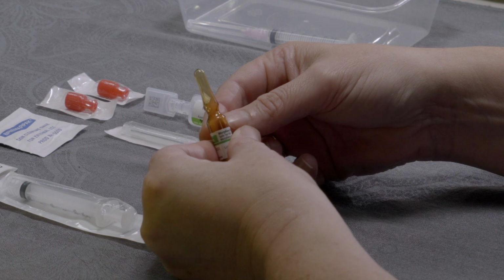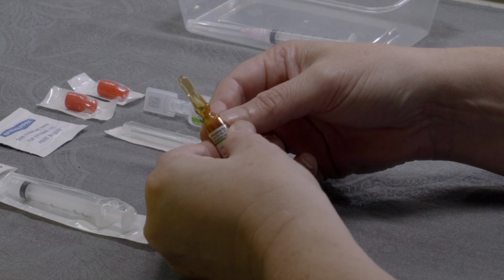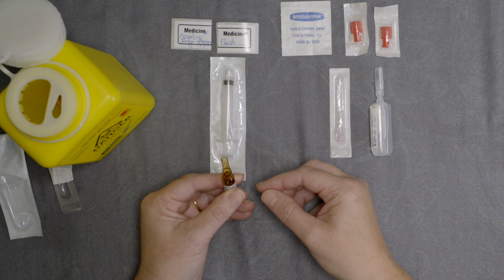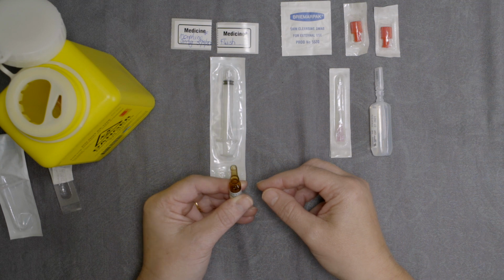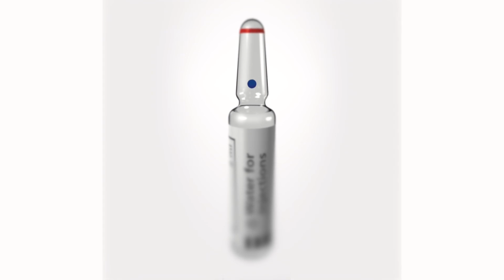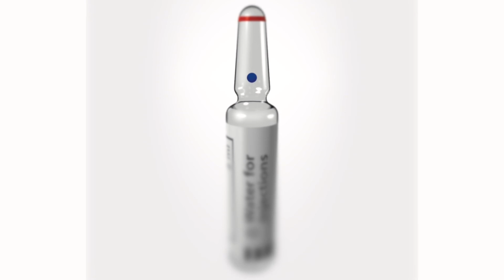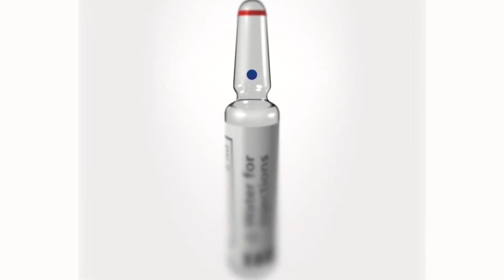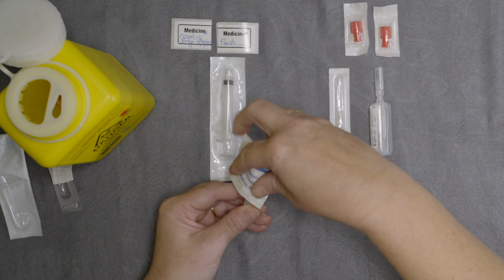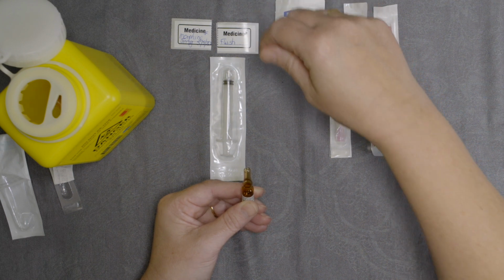Now that all the liquid is in the bottom, you will need to snap the top off. To do this, hold the ampule in your non-dominant hand and have a quick look to see if there is a small dot anywhere on the top. This dot represents where the top will break most easily, so we can use this to guide where we will put our thumb. You may also wish to fold the alcohol swab around the top of the glass to help break the ampule and protect your fingers.